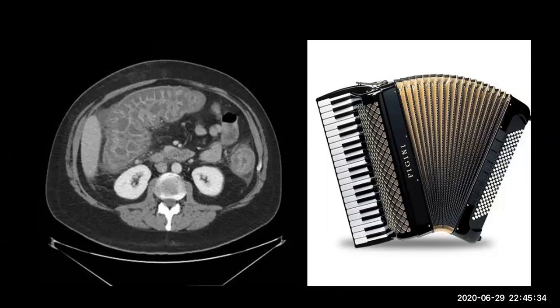Okay, next case. Any spot diagnosis? Accordion sign. Where can we see this? Pseudomembranous colitis. It is specific.